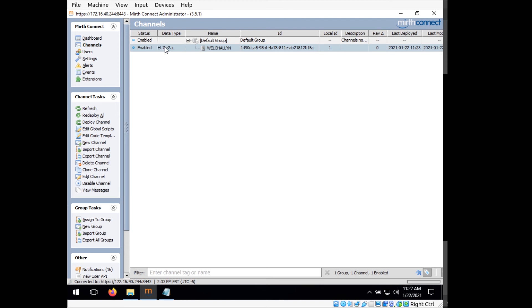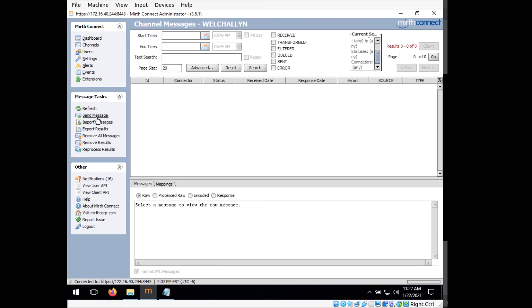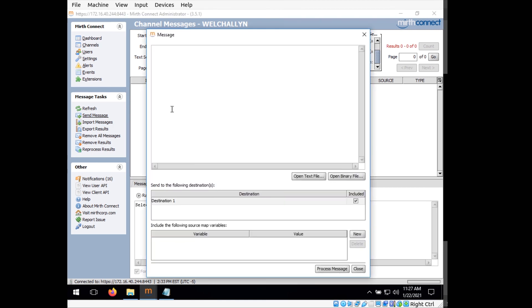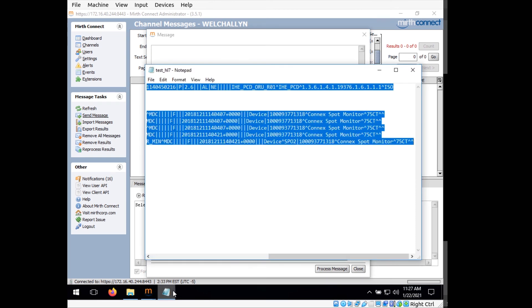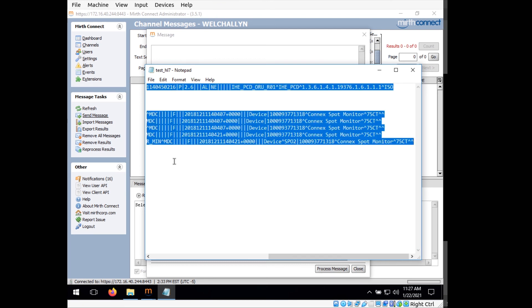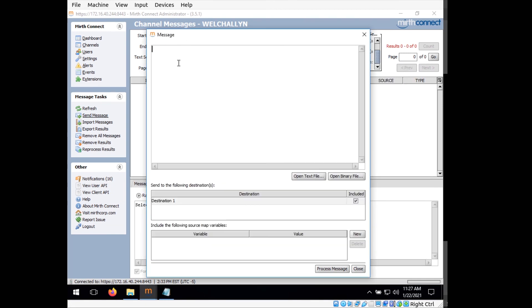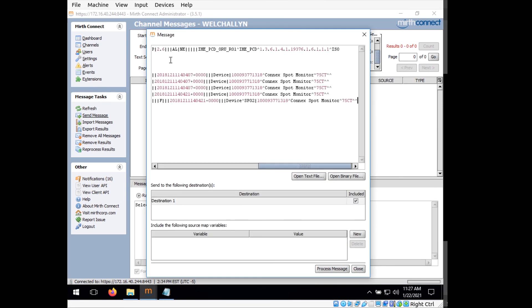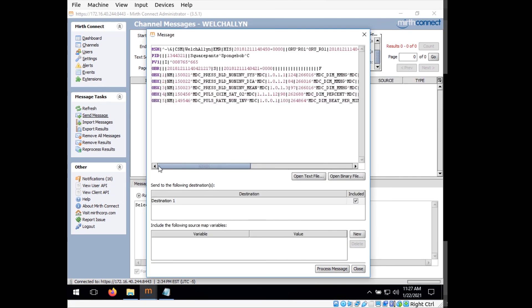So what we'll do is we'll make sure that we're on the channels page and select our Welch Allyn channel. Go down to view messages over here, and then click on send message. And in here what we want to do is copy over the example file that should be included, which should contain this example HL7 message. So on this I'm just going to control A and then control C to copy it. And then go back to our message here and control V to paste it. So we just copied the contents of that file over to here. And now we can click process message.